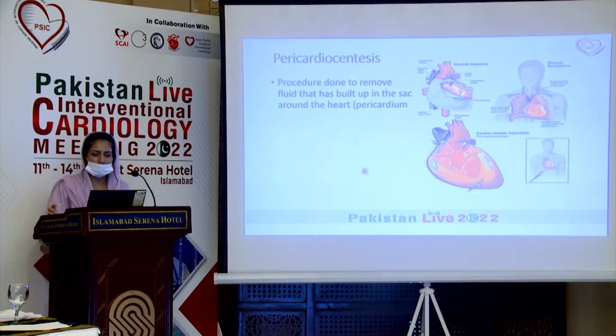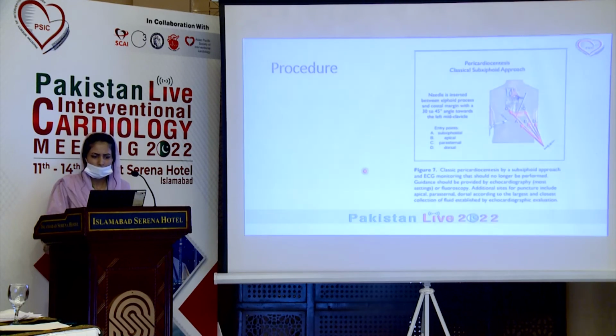Pericardiocentesis is a procedure which is done to remove the fluid that has built up in the pericardium. This is the picture of the procedure, in which we can see different entry points of needle insertion: subxiphoid, apical, parasternal, and dorsal.